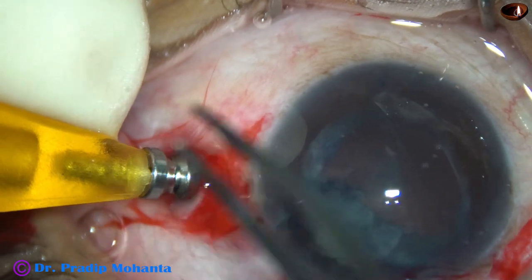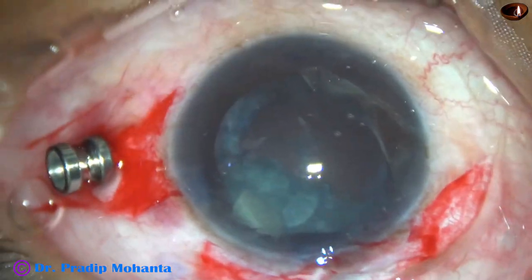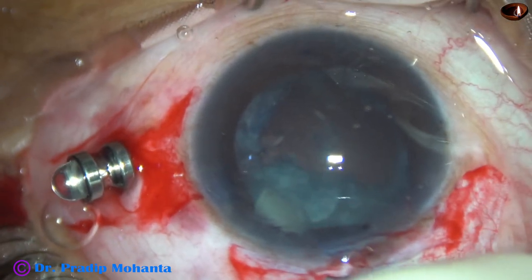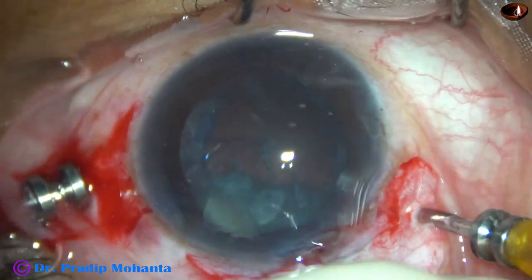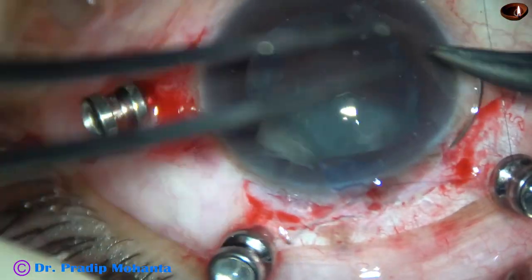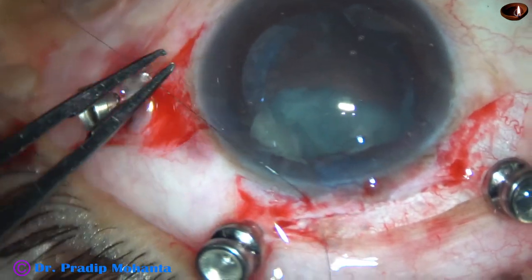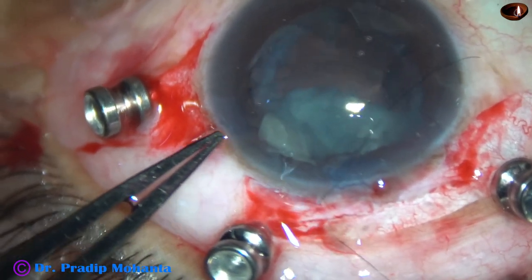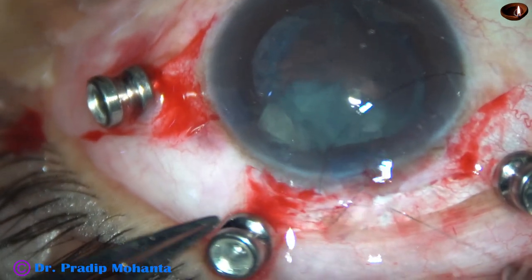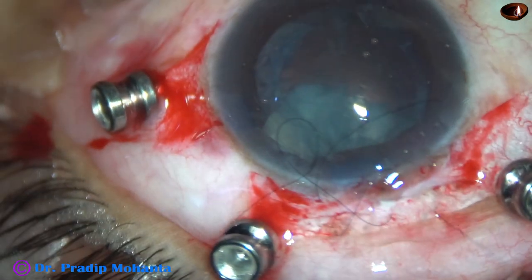Now my plan is to apply three trocars — this one is for irrigation. Note: this is an edited video, and in some parts the surgery has been played at high speed, about four times normal speed. This is the temporary closure of the sclerocorneal wound.